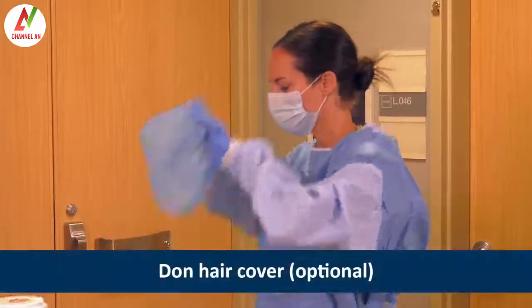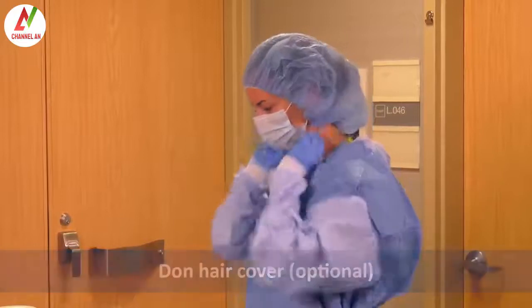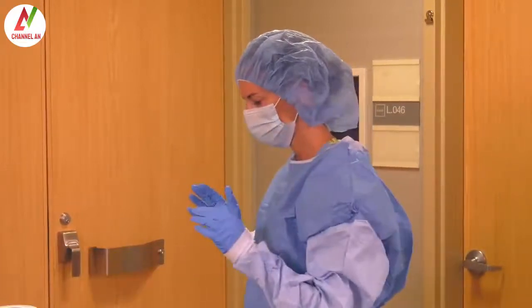Next, Heather puts on a hair cover. It should cover all hair and the ears. This step is optional and should be skipped if using a PAPR.